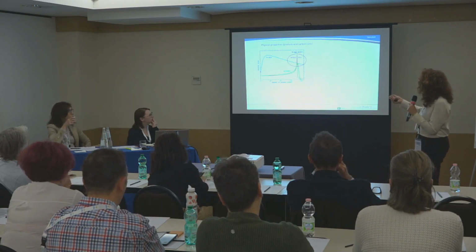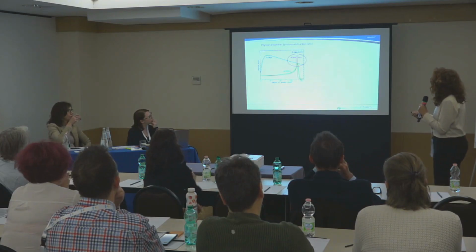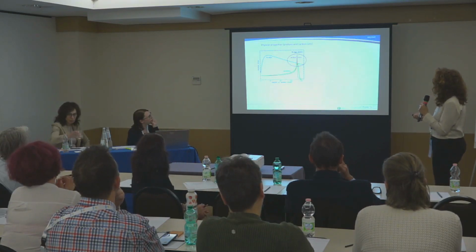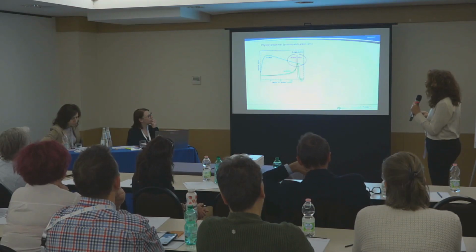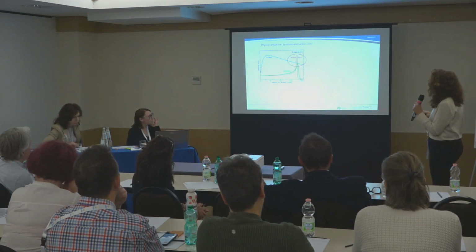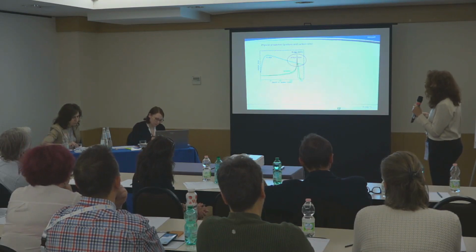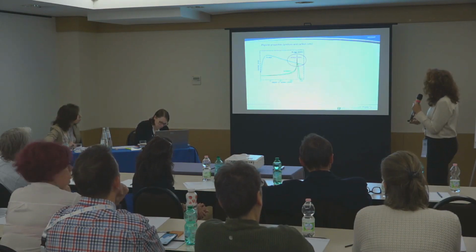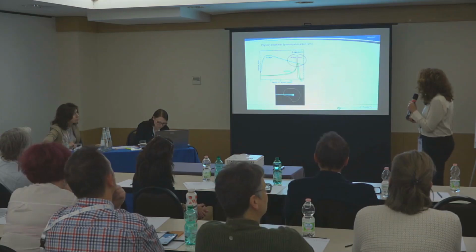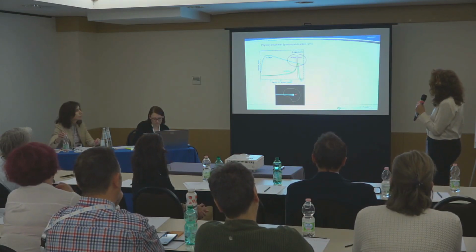So you can see in this picture the behavior of the released dose of proton and carbon ions: very low dose in the entry tissue, and the maximum released dose at a definite, precise point in depth where the tumor site is. This is a different behavior from X-ray, which releases high dose at the entry of the tissue. This is the behavior of a single particle, an example of a single particle in a regular tumor shape.